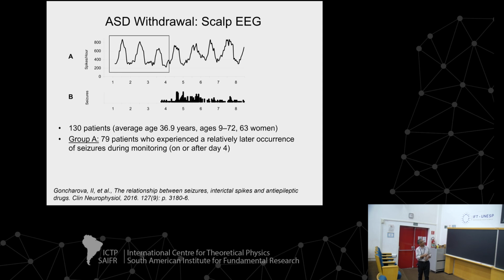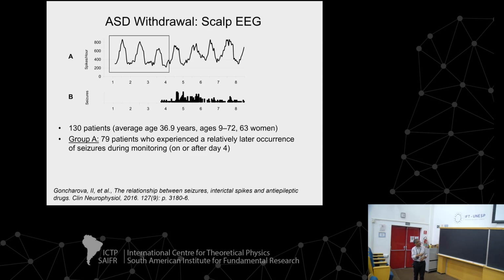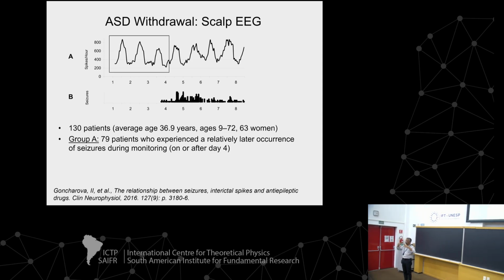We'll focus on the first 3 days, and you can see in the scalp a broad, strong diurnal change in spike counts. But we also see this decreasing trend. So at least we're seeing some aspect of what we see with the intracranial signal, and these are patients that didn't have surgery to place electrodes. So for us this was a confirmation, or some support, that what we're seeing intracranially is also reflected in the scalp EEG signal.